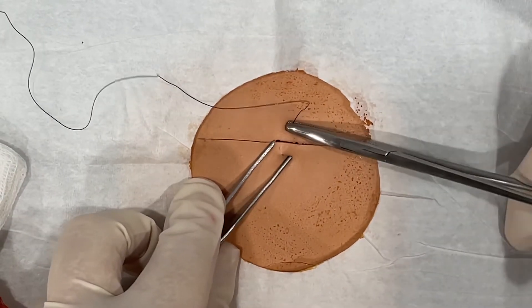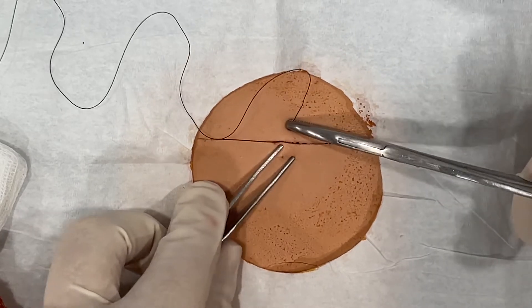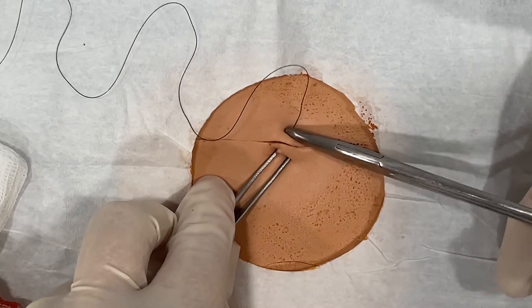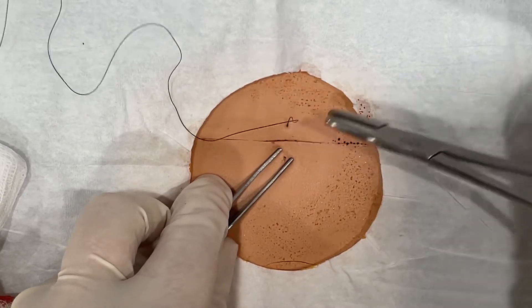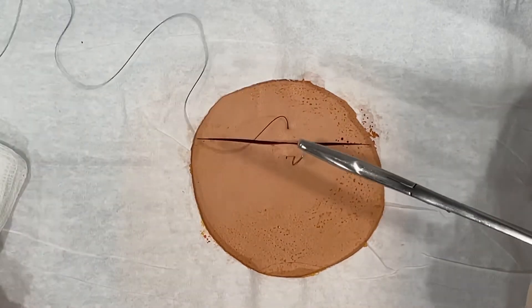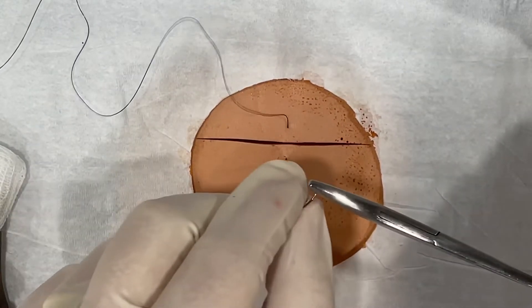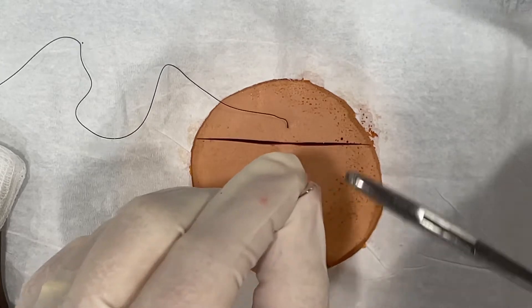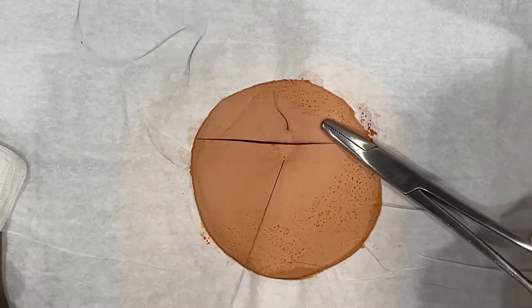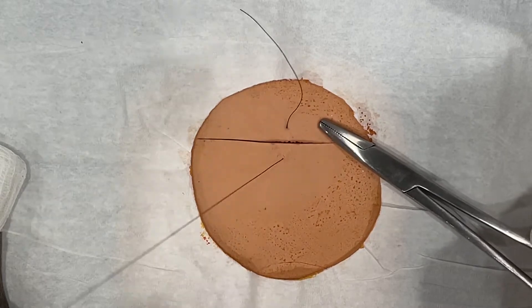When you go in the skin, rotate your instrument until you see the tip. Sometimes it needs a little help — come through. Take your needle carefully in between your thumb and index finger and pull the excess. Leave yourself a tail.